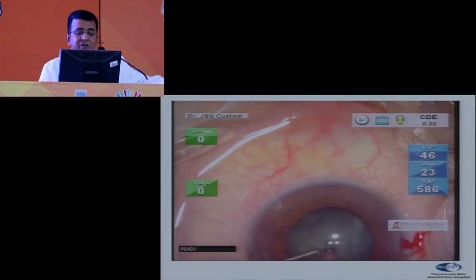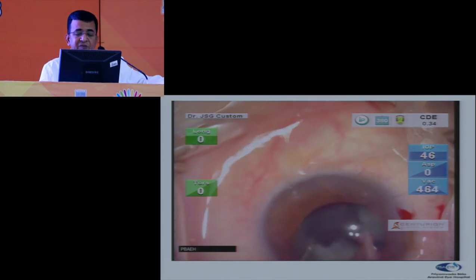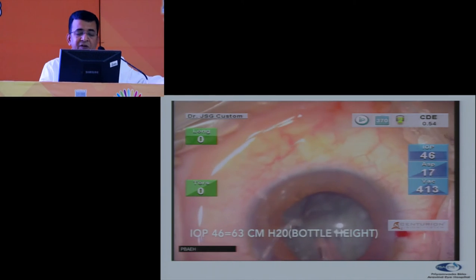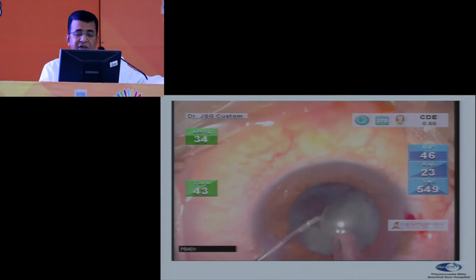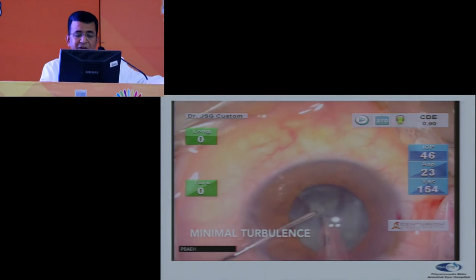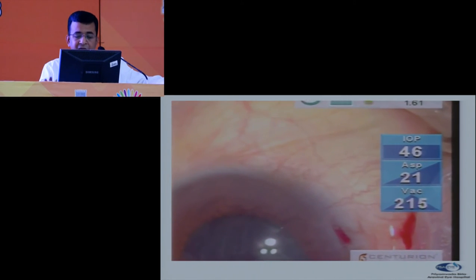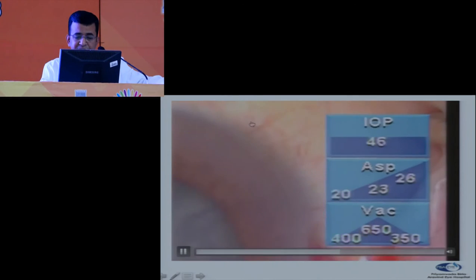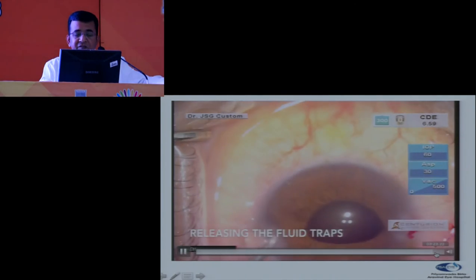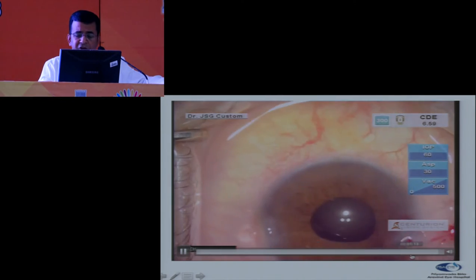So once I start off the procedure, there is a classic bellowing of the iris diaphragm, but that is the time I take for the stabilization of the intraoperative pressure and the pupillary size. So once my pupillary size is maintained, I can initiate the crack, and this is at a bottle height of around 60 centimeters. There is nothing much in the surgery, only it shows that there is a minimum amount of turbulence, and we can carry out the procedure while maintaining the iris in its position. And finally, we can have a situation like this, where we have a proper bed for the intraocular lens implantation.